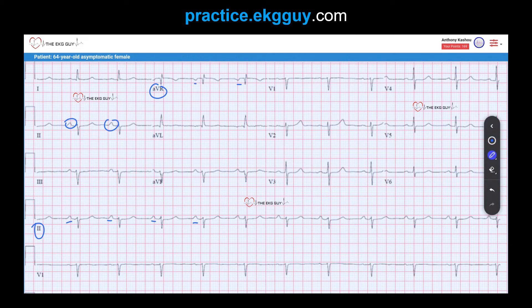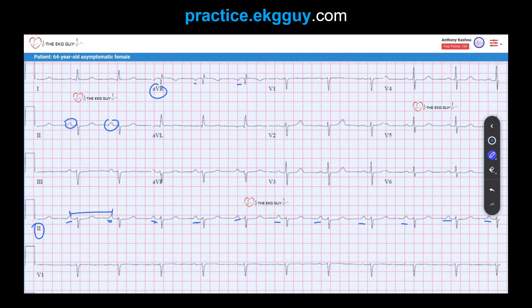Given that, along with the frontal plane axis, the P-wave axis is normal. These findings, in parallel with the constant P-wave morphology throughout, and the constant P-to-P interval, suggest sinus rhythm. So the constant P-wave morphology, regular P-to-P intervals, and normal P-wave axis all confirm sinus rhythm.